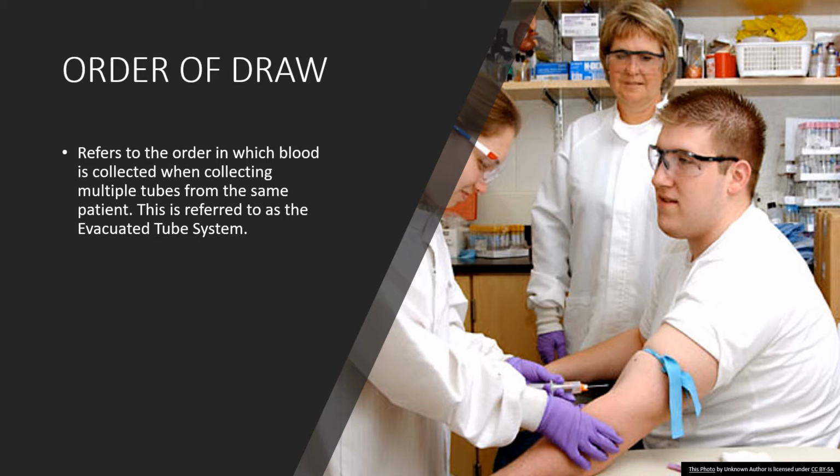And inside that holder, when you put that needle on there, there's a needle on one end that you see sticking out that goes into your patient's vein. On the other end of that needle, inside that clear plastic evacuation holder, is a sheathed needle. That sheathed needle is the needle that, when you press your tube, whatever color top tube you happen to be drawing at that time, into that holder, punctures that tube, and that tube is evacuated.